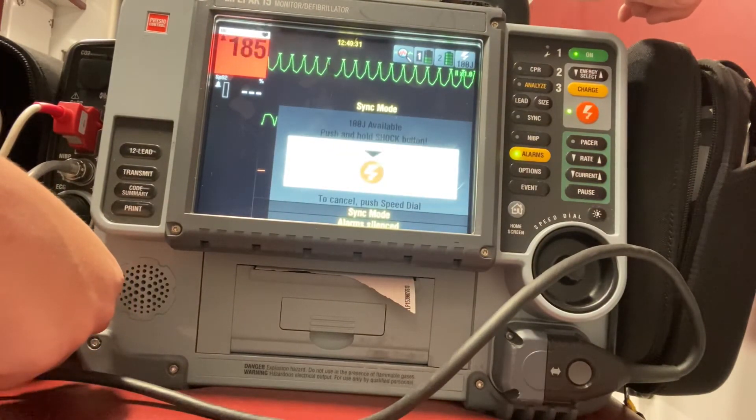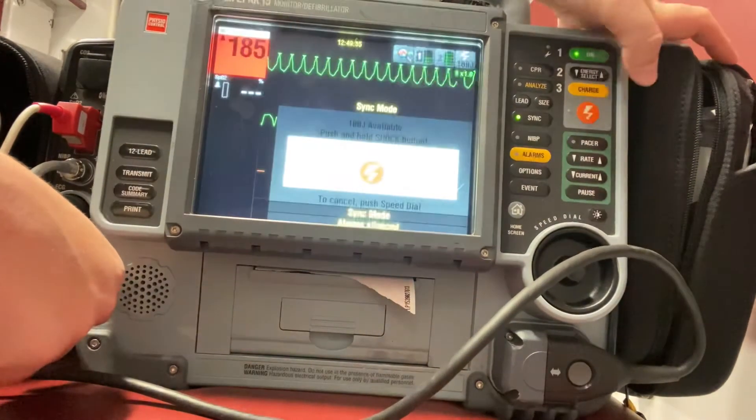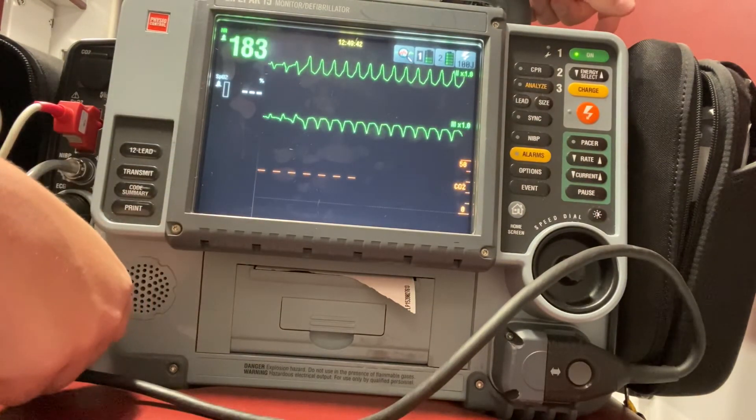I'm going to make sure everyone's clear of the patient, hit the shock button, and deliver the shock. As we can see, my patient is still in ventricular tachycardia.